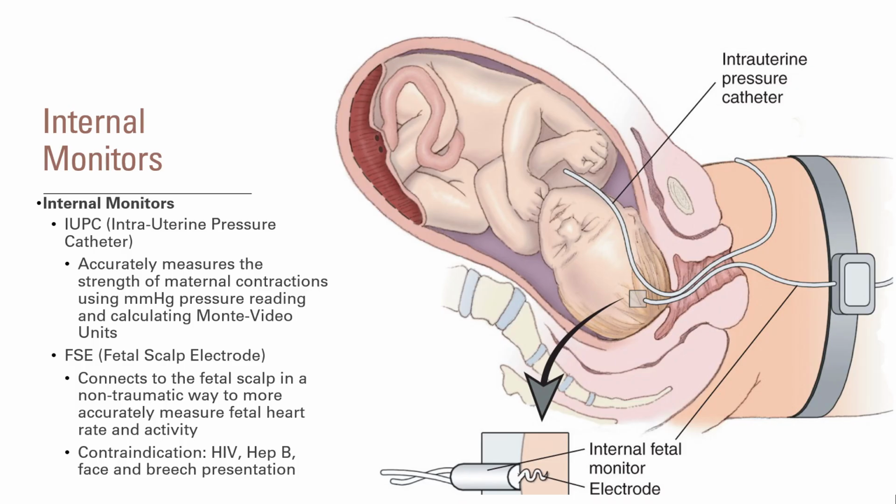There are a couple of contraindications for internal monitors. So obviously if a mom is HIV positive or hepatitis B positive, or if we have face presentation or breech presentation, we do not place any of these items. However, again, every situation is a little bit different. It's going to be case by case, but for the most part, these are the contraindications for internal monitoring. And on your clinical skills and simulation day, you will actually see these devices in person. You'll be able to see and touch and feel and so forth.